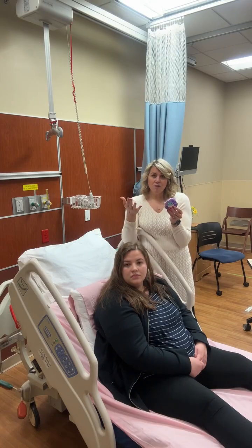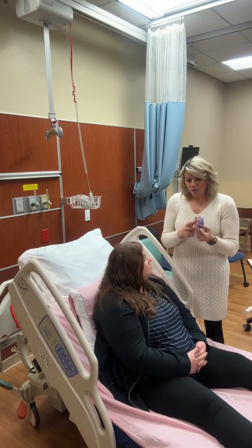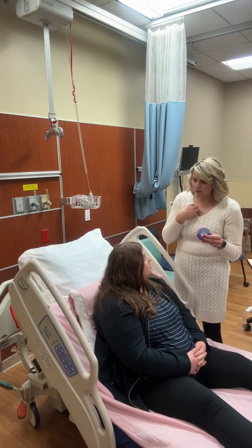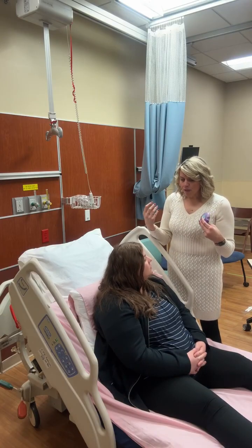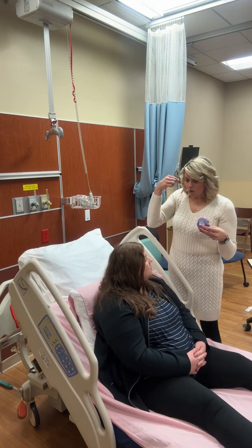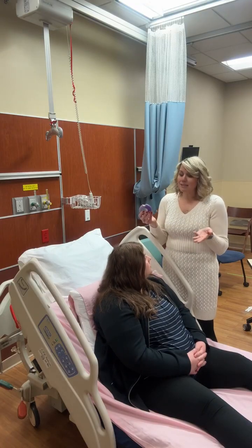So the instructions for how to use this is basically you want to make sure that you know why you're using it. So actually this is Advair. This is 100/50, and this is a corticosteroid, which means that it is a steroid that is going to reduce the inflammation in the airways, okay? So there's inflammation in there from your COPD or asthma, and so what we want to do is reduce the inflammation so that there's more airflow, so that our bronchodilator, when you take your nebulizer, the medication can get deeper, and that's how that works.